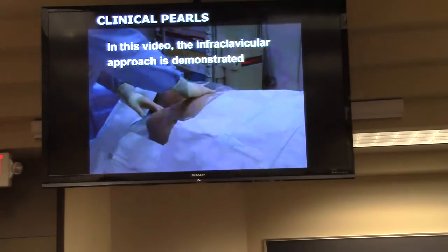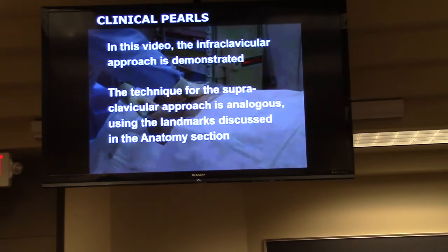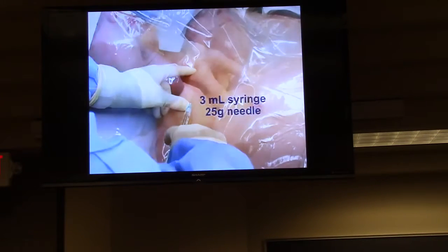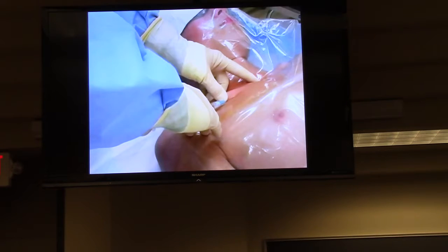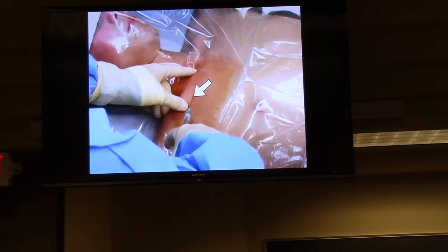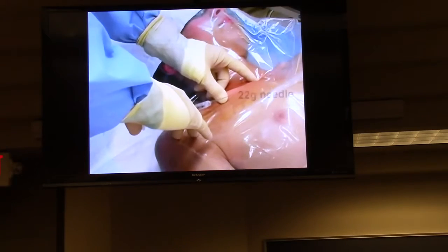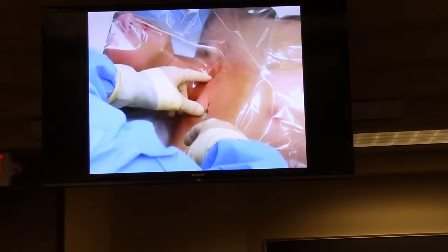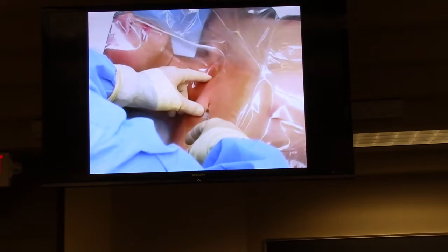In this video, the infraclavicular approach is demonstrated. The technique for the supraclavicular approach is analogous, using the landmarks discussed in the anatomy section. Using the 3 milliliter syringe with the 25 gauge needle, place a wheel of local anesthetic at the needle entry site, which is 1 to 2 centimeters inferior to the junction of the proximal and middle thirds of the clavicle. Switch to the 22 gauge needle and anesthetize the subcutaneous tissues and the periosteum of the inferior border of the clavicle.